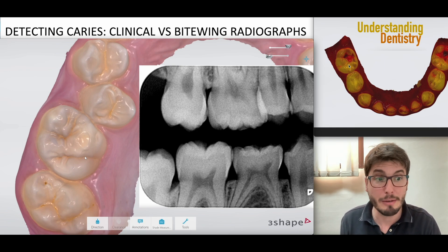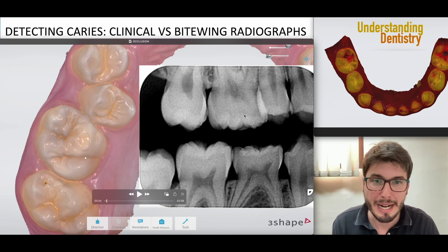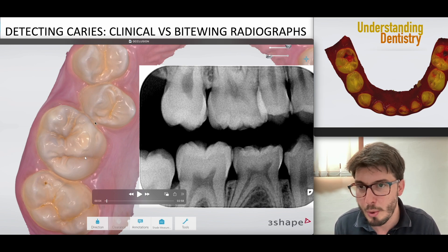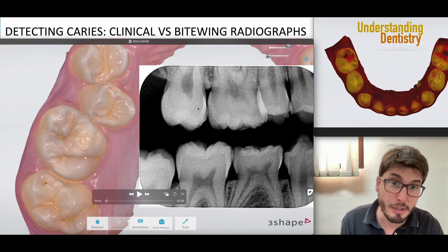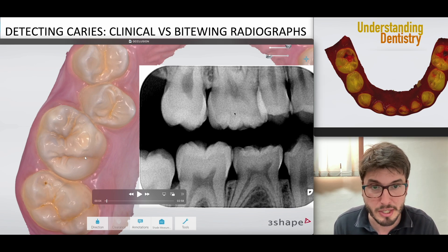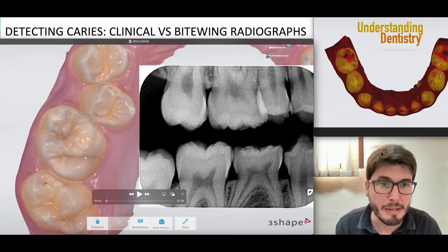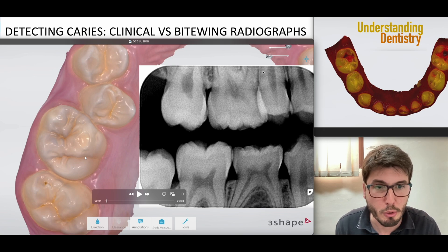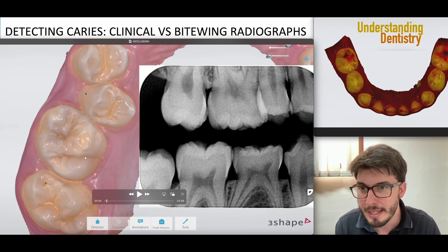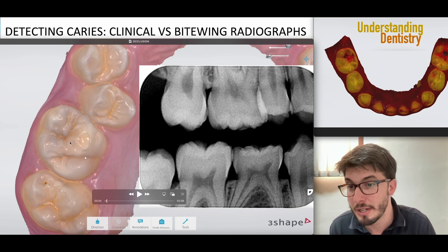Let's analyze some cases. Here we have the first one: these molars with the bitewings, showing the upper right quadrant of the patient. Let's focus on the upper teeth. You're realizing that the premolar is superimposed on the molar because this second premolar is actually palatal in relation to the first molar.